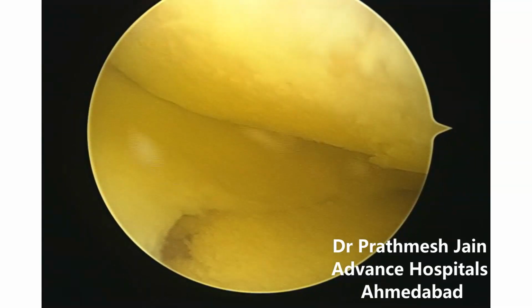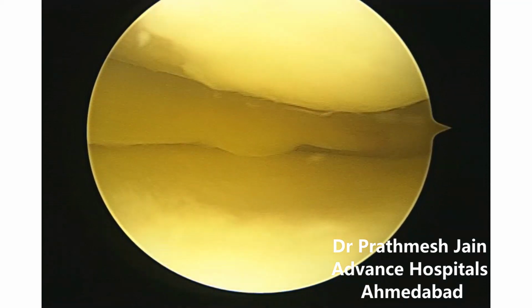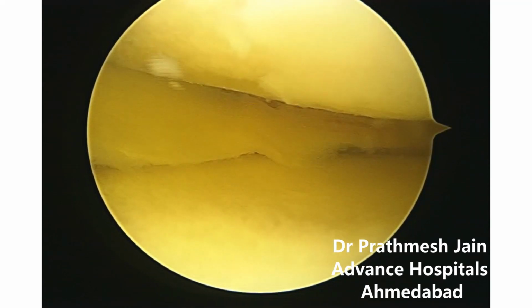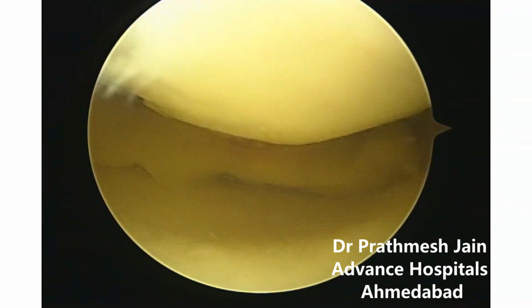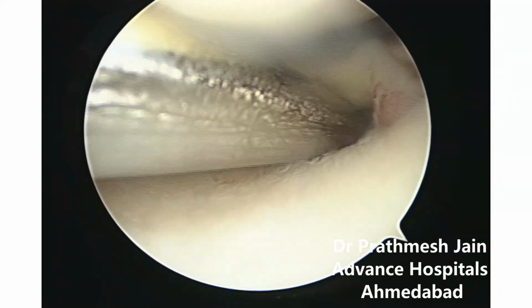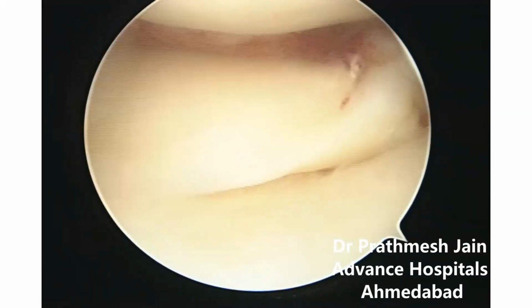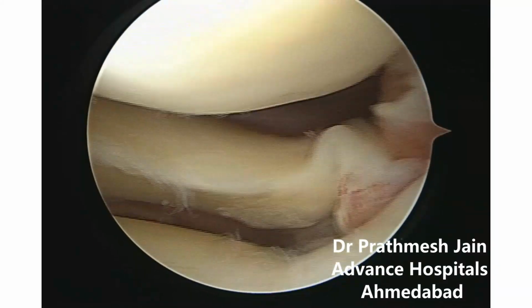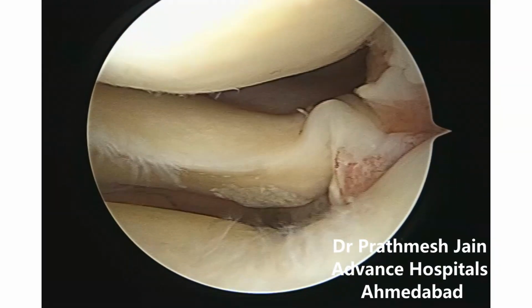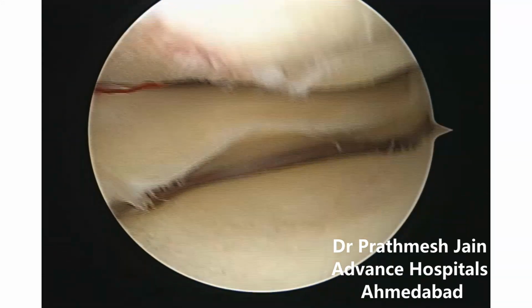So what we will do is we will just see, and then we can see that there is a chondral lesion at the anteromedial edge of the tibia, and then we will just do a pie crusting of the medial compartment to increase the space so that we can approach the posterior as well as the anterior parts of the knee. We will prepare the posterior remnant, and when we just pull it, we will see that the root is detached from its insertion. This needs to be appreciated nicely.